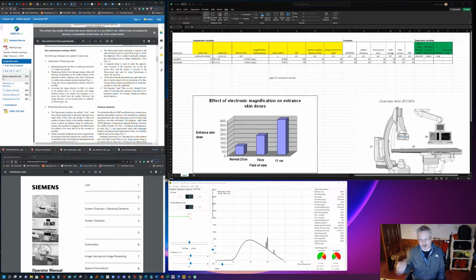Not unless you're removing a grid as well to leave an air gap instead of a grid. Well, they're not doing that. They're leaving the grid in, I think, in this case. So 4 things at once. Now, you can criticise papers for doing too much because it becomes quite complicated and it's very difficult to understand which of the 4 changes is the most significant. So that's the only criticism, that this paper has got 4 changes going on at once.